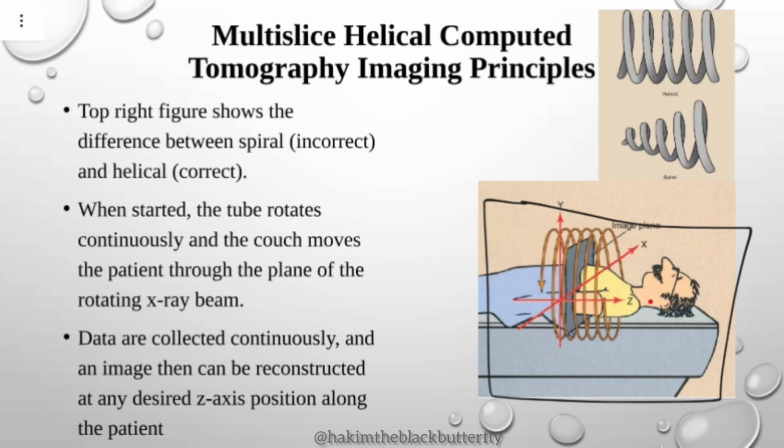Spiral means that something is rotating, but the diameter of the circular path keeps on reducing until it spirals into something or converges into something. Whereas helical, the diameter of the circular path does not reduce. So there is no convergence.